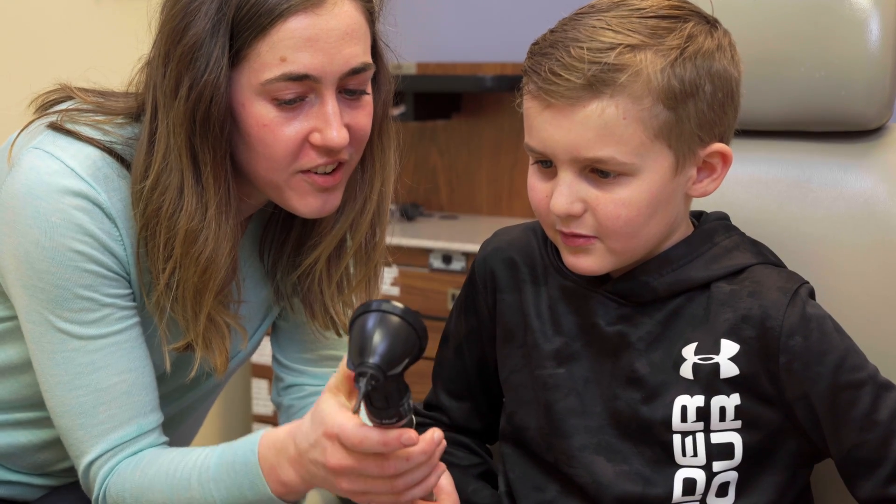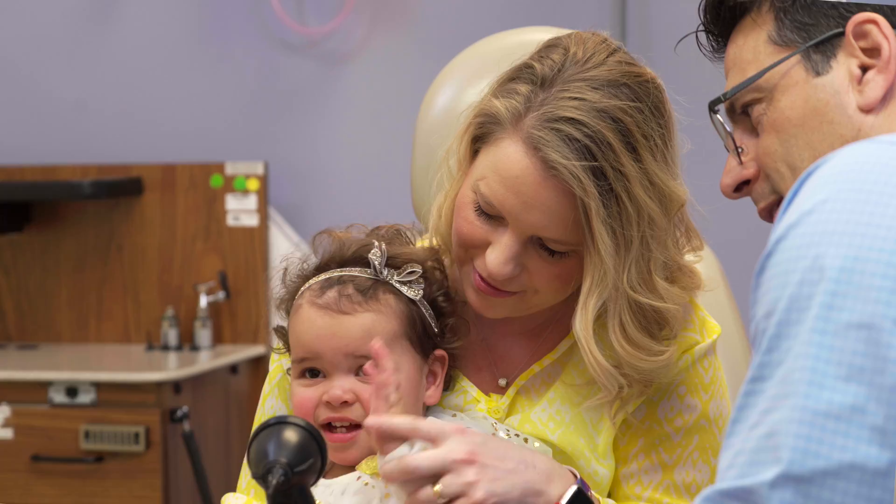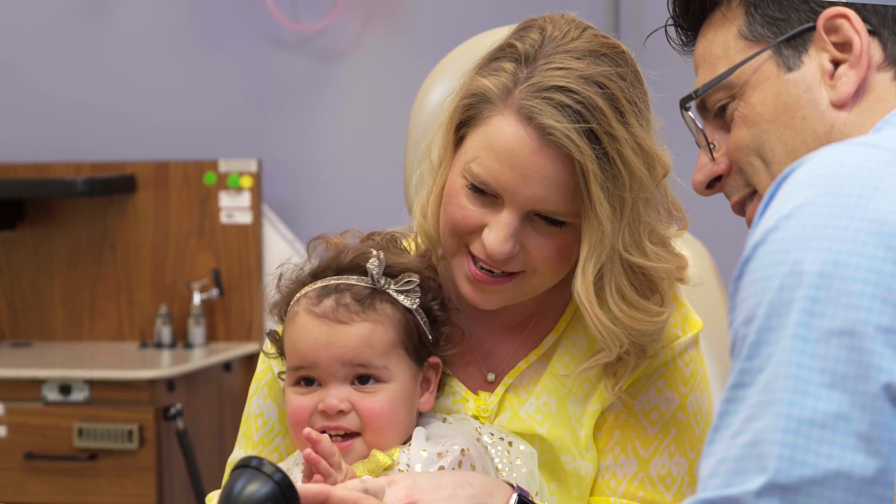One of the things I like best about the Whisper otoscope is that you actually get to share the experience with the family and the patient. They leave feeling completely confident in your diagnosis.